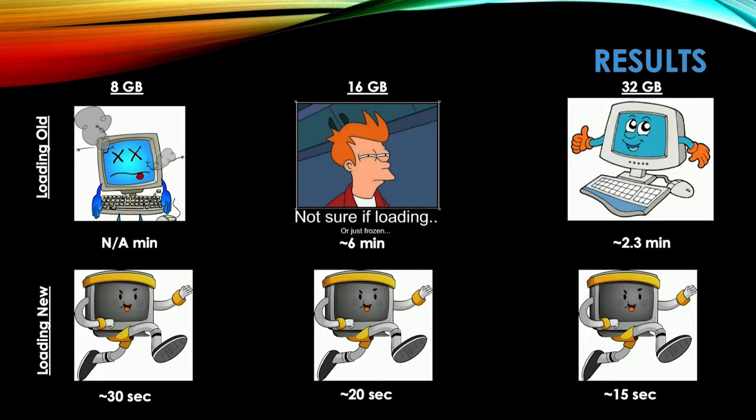As Grant mentioned, we really reduced the size of data that your computer needs to hold at one point. Before it was around 10 gigs, and now it's down to about 1 gig that it needs to hold in memory. And we can do all this pre-processing before we even hand someone the tool. For clinicians, I think it's going to be great, just packaging all the data that they want to look at, and then they don't have to sit around forever.